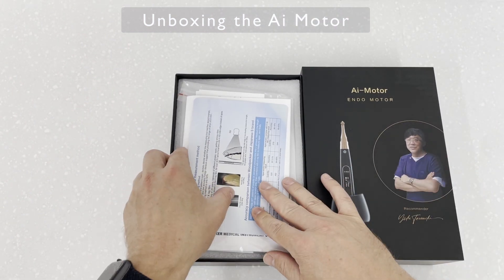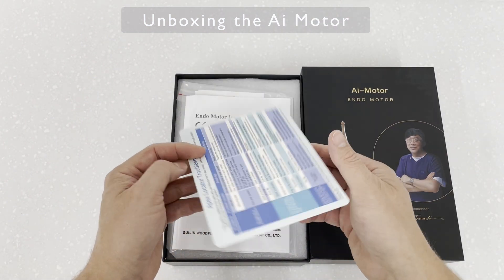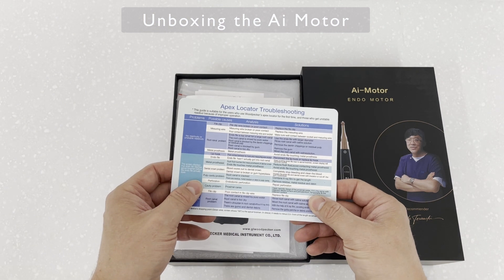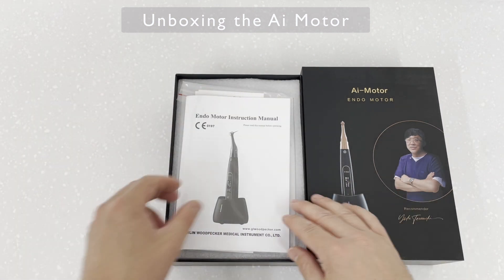The information found in the box isn't too bad. The Apex Locator troubleshooting guide is pretty good, but the instructions for the handpiece itself are quite an unusual read — and once you've seen it, you'll understand.